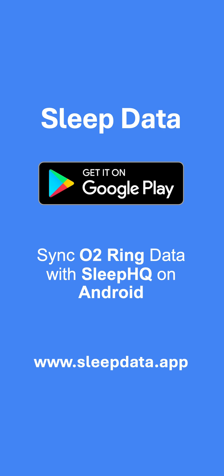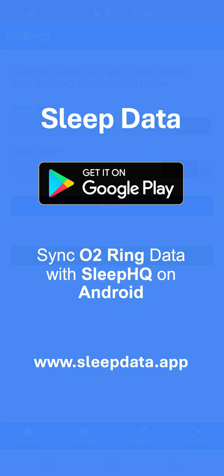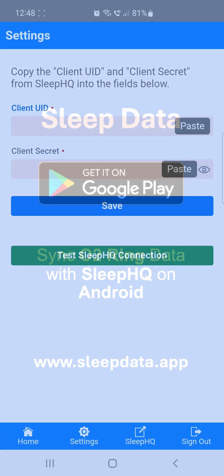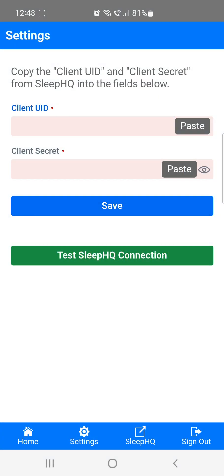First, head to the Google Play Store and download the app called Sleep Data. Once the installation is complete, you can either create a free account or sign in with your Google account if you have one. After you've signed up, the first thing you'll want to do is go to the Settings section.